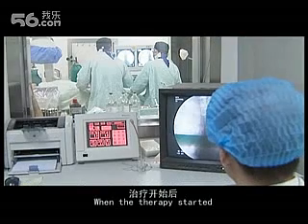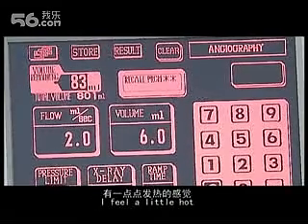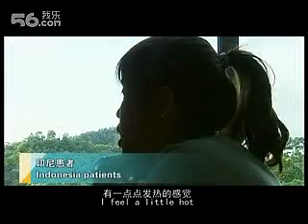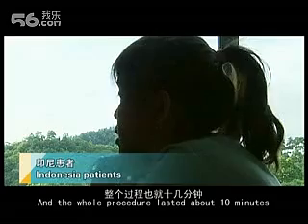During the operation, the patient may feel a slight sensation of heat. The procedure typically takes about 10 to 20 minutes.